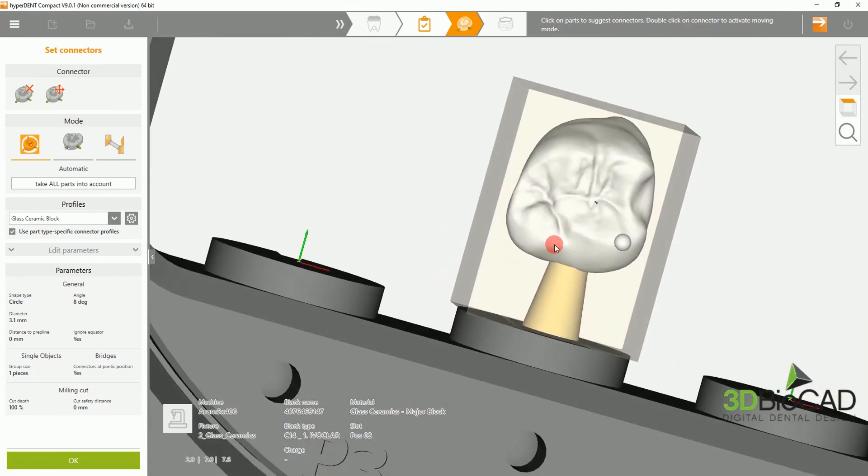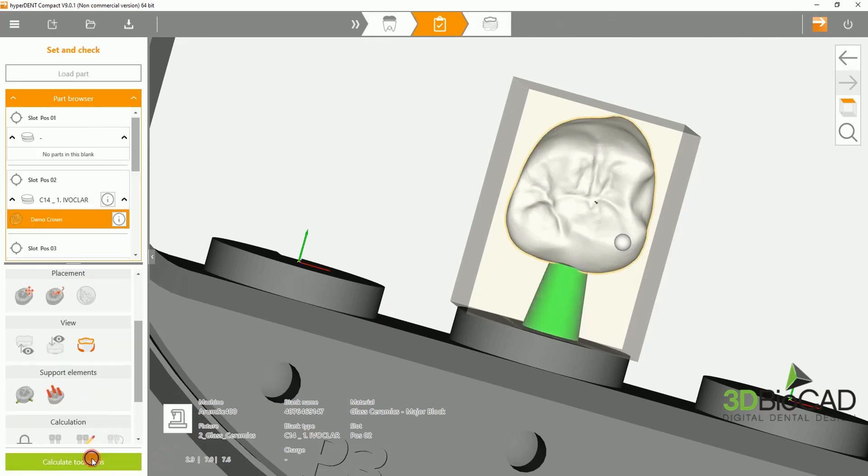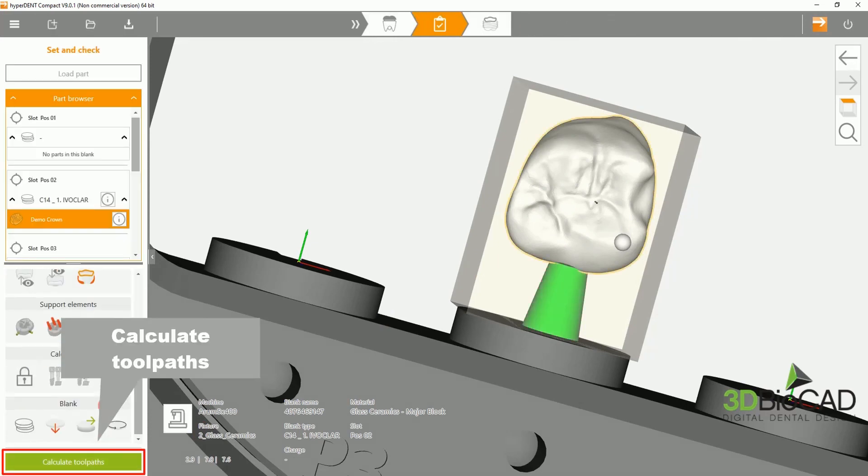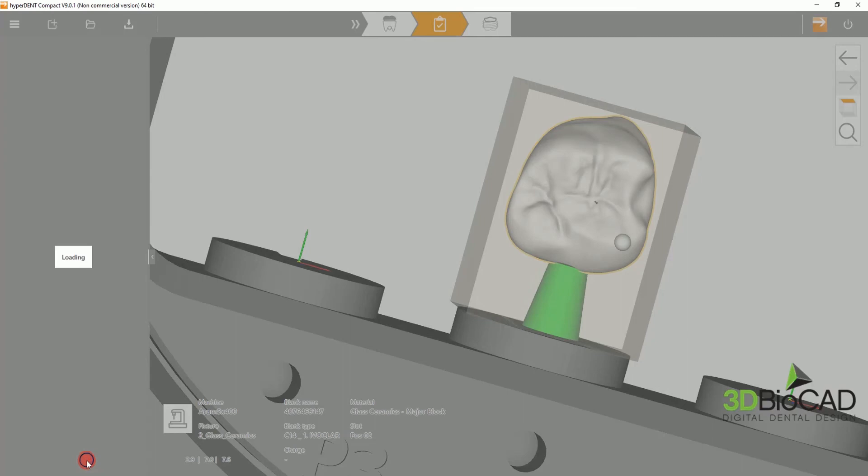After selecting OK, you can now calculate your toolpath.